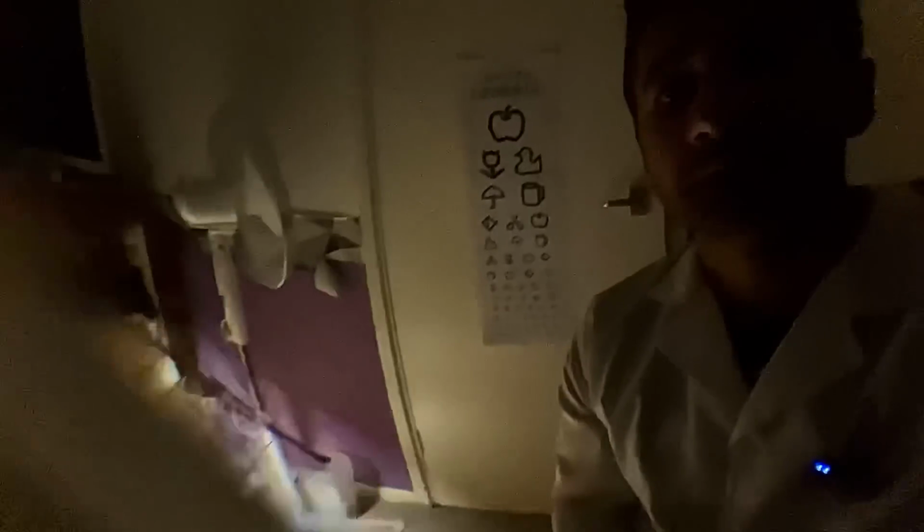And here we are, arriving at the final spherical lens. It appears as though we have a minus 14 lens based on the retinoscopy results. A minus 14 lens. So, how much clearer is this lens? That's with it, and that's without. With, 100% better. Excellent. Okay, let's pop the lens into the frame there and bring your vision back for some final refinement checks.